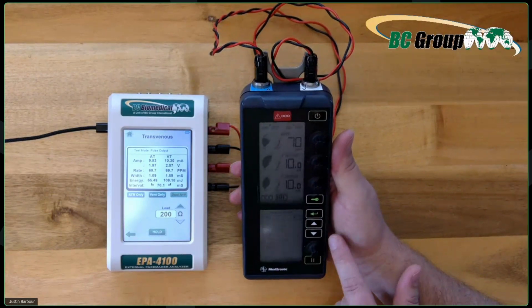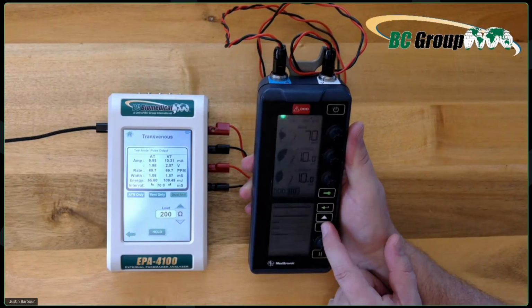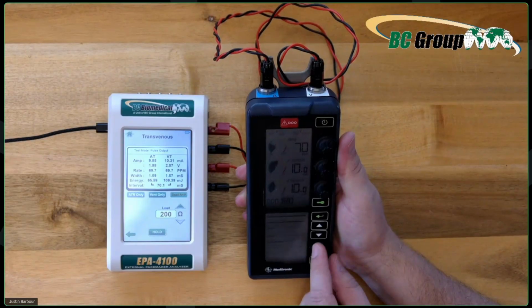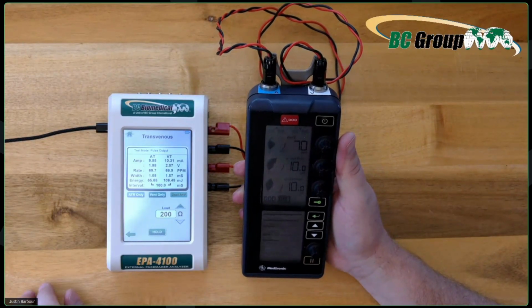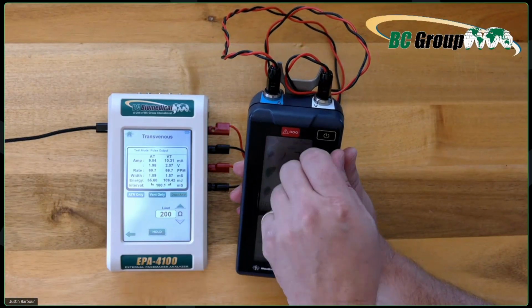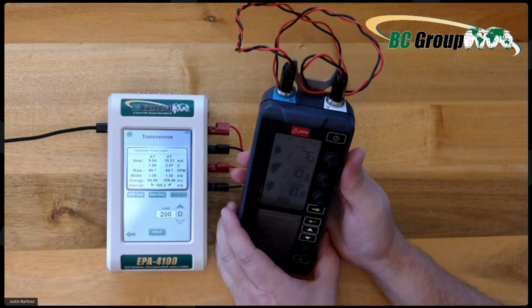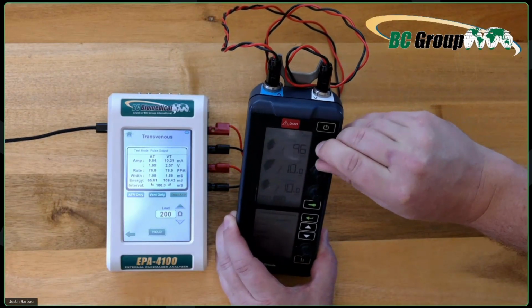Okay, 70, 10, 10, and let's go down and change the AV interval back up to 100 milliseconds. The reason that I like testing things in 10s and 100s is because it gives you an instant 100% that you can mentally calculate.